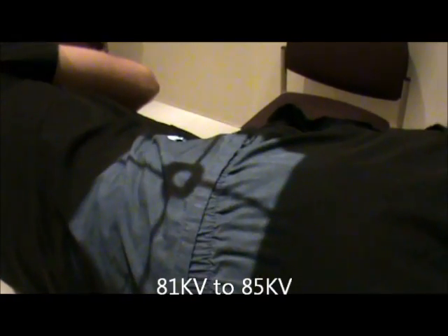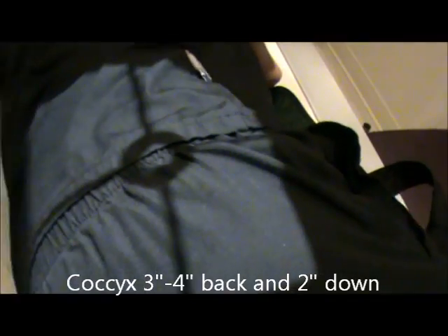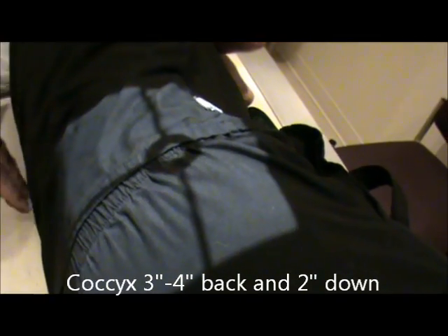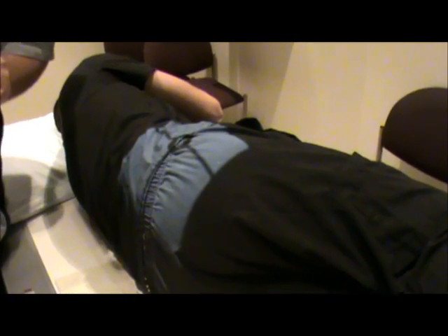For the lateral coccyx, we still palpate the ASIS and go three to four inches back. From that point, we go down two inches. That will be our centering. We'll adjust our marker so it's still in the light field, still use our lead blocker, and technical factors remain the same — 81 to 85 kVp. And this will be our view of the coccyx.